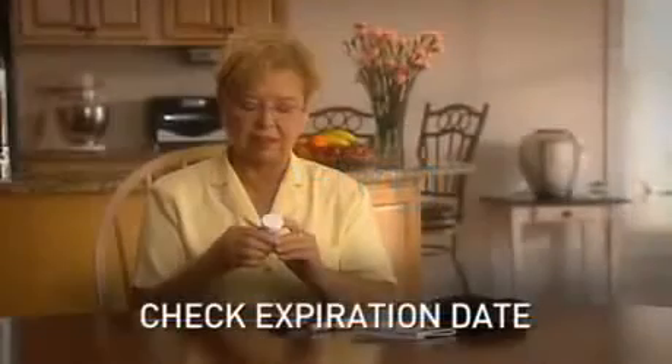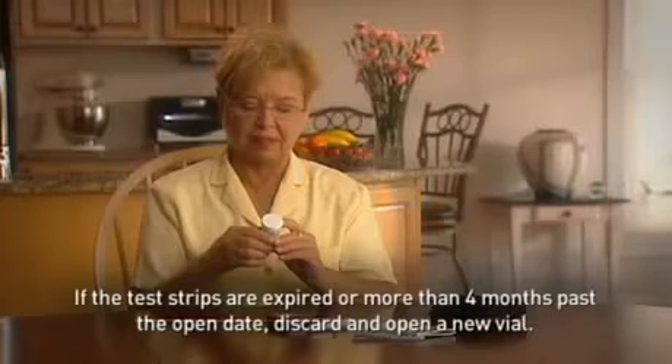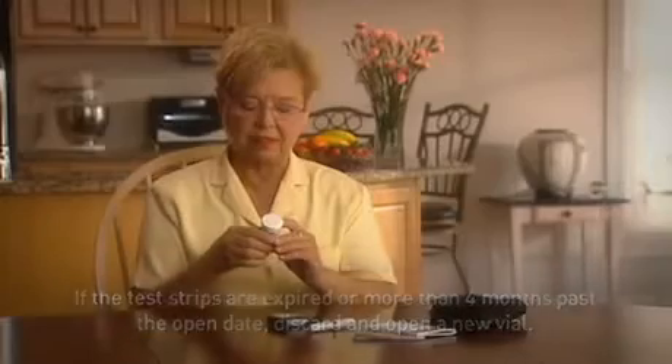Now let's perform a blood glucose test. Make sure you check the expiration date on the test strip vial before testing. If the test strips are expired or more than four months past the open date, throw them away and open a new vial. This simple yet critical step will ensure testing accuracy.